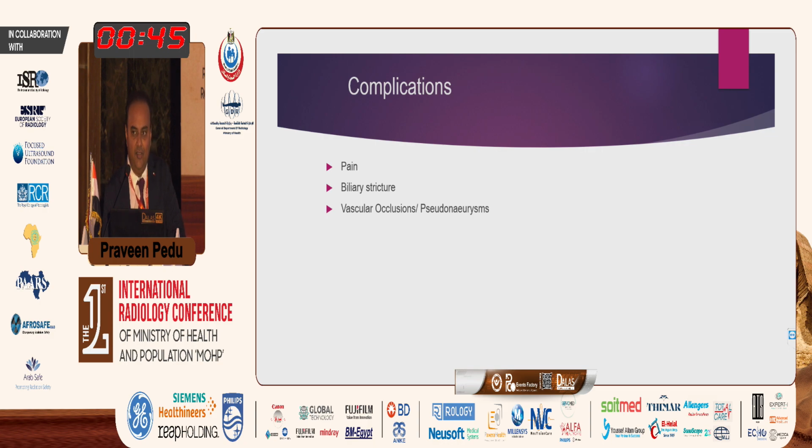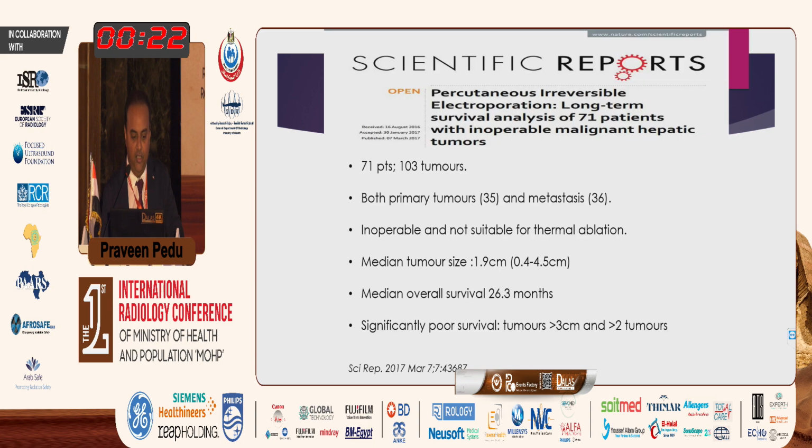If you transgress the bile duct, if you put needles across the bile duct, you can still cause inflammatory temporary strictures, so something we need to avoid. And if you puncture the artery on your way in, you can also cause vascular complications like pseudoaneurysm. So it's not completely devoid of complications. You need to take your due precautions, making sure you do not transgress the artery or the vein while you're placing the needles in. Otherwise, it's a very safe procedure.